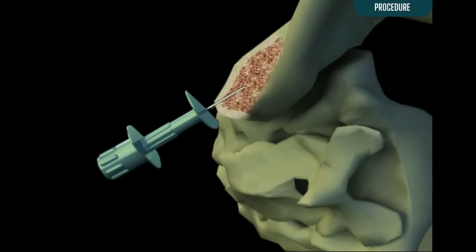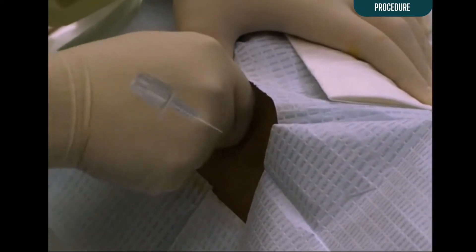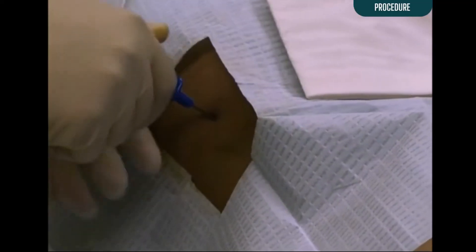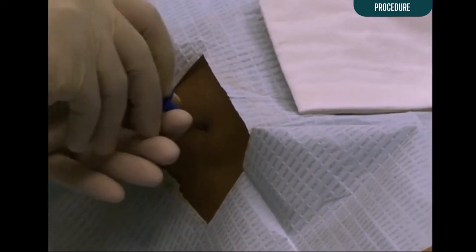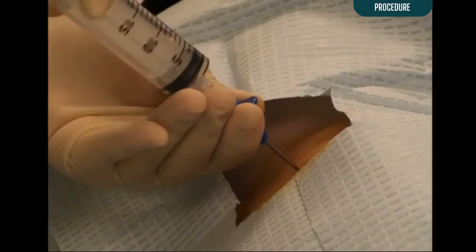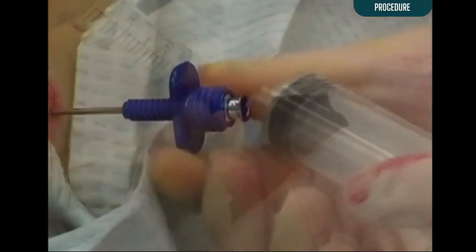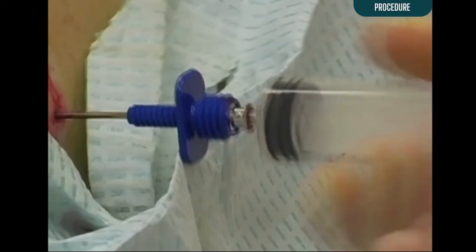However, the angle of entry is important. In general, the needle should be advanced at an angle completely perpendicular to the bony prominence of the iliac crest. Once the needle is through the cortex and the marrow cavity is entered, the needle should stay in place without being held. Next, remove the stylet. Attach a 30 mL syringe without heparin and aspirate 1 mL of marrow with a firm pull.